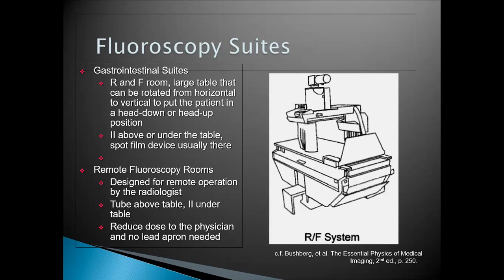When one is undergoing an operation and wants to see the real-life procedure at some point in time, then the orthopedic surgeon, the neurosurgeon, the fluoroscopist, or whoever, has to be in the room, except if they want to use a robot to do the operation, and they can continue to operate the robot from a remote room.